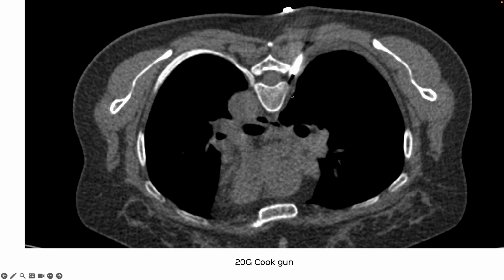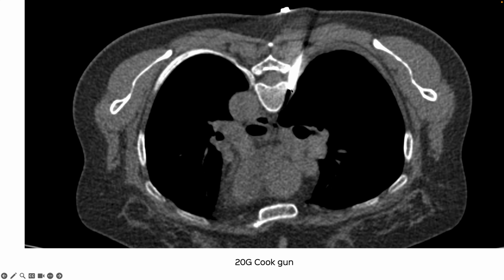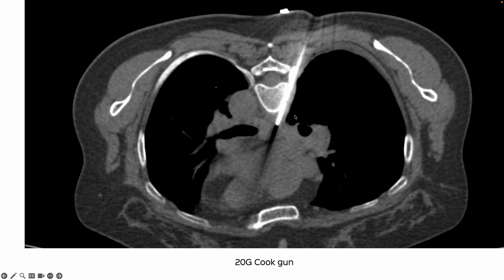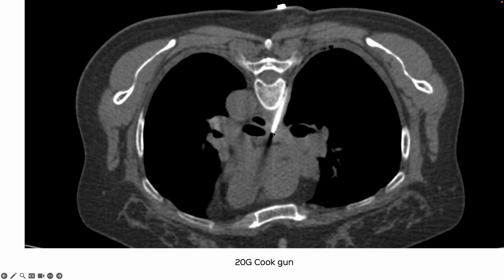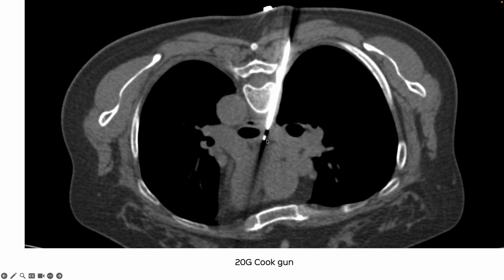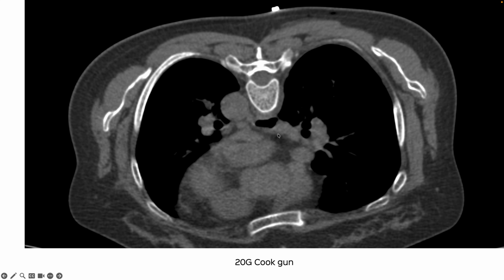You can see the space that has been created, pushed the needle further through, injected a combination of saline and lignocaine, created even more space, then into the lymph node, pierced it, withdrew it a little bit, deployed only a 5 millimeter of the gun instead of 10 so that I wouldn't overshoot, and that's the biopsy through the subcarinal node.